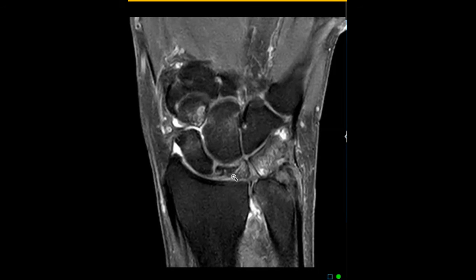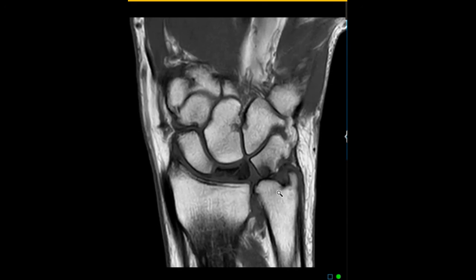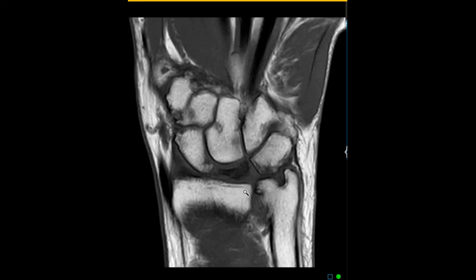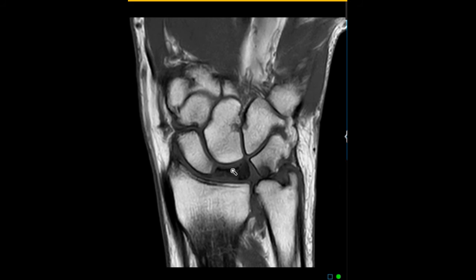Just to talk more about lunatomalacia or Kienböck's disease — this can be from a few things. One thing that may predispose to this is the ulna: sometimes the ulna is too short, and when it's too short, there'll be abnormal load on the lunate bone as it articulates with the radius, and that can lead to lunate collapse or avascular necrosis. In this patient, it looks like there's no negative ulnar variance — it's more of a neutral or minimally positive ulnar variance, so that does not predispose to this.